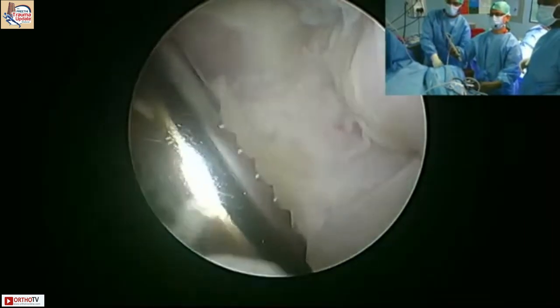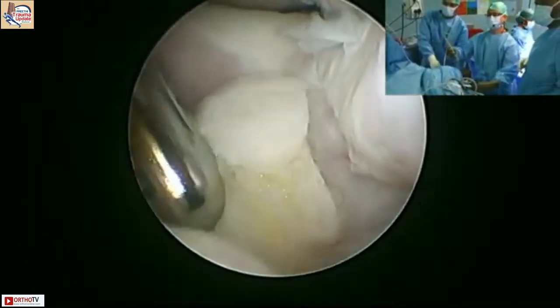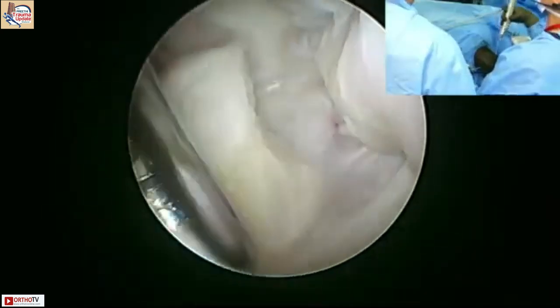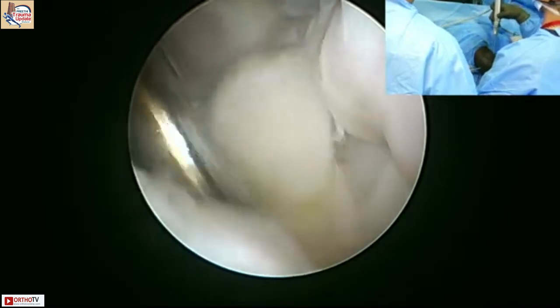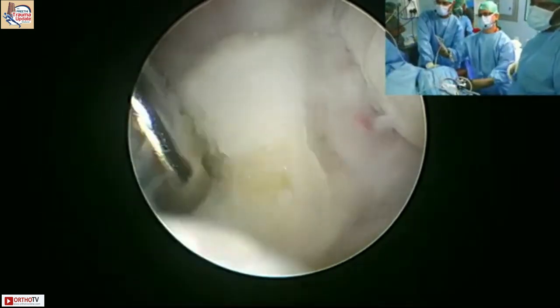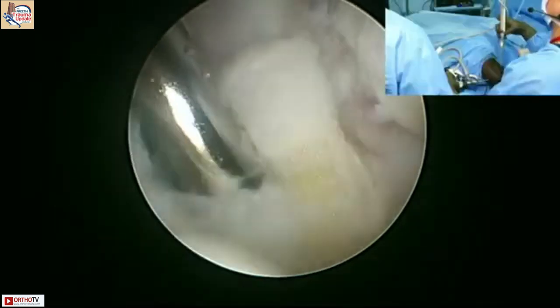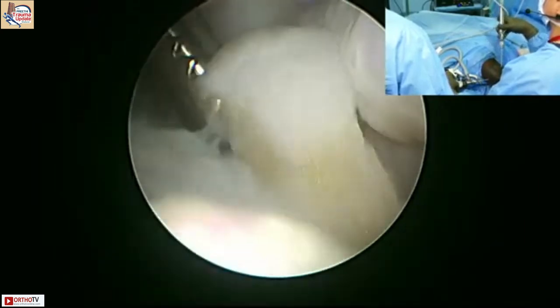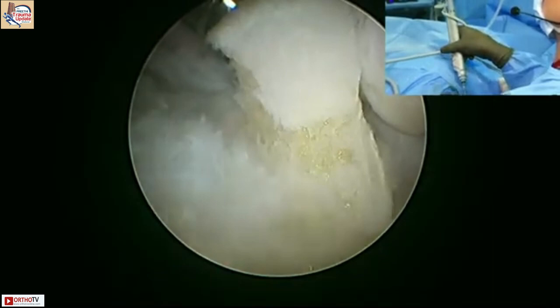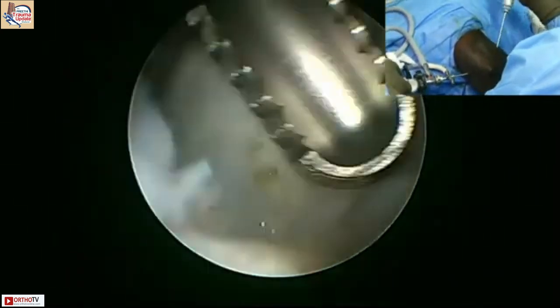Okay, so you can see this. Yeah. This is a good sign, which means it is more or less getting loose. But I think I might just eat this up. It will take me a little while. It's a soft bone. If not, then I will grab it, because my portal is small. Reassess. So only this much is left now.